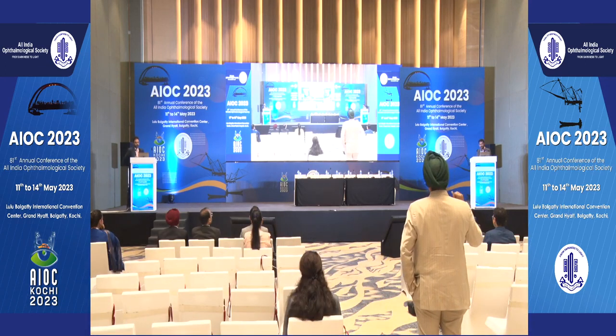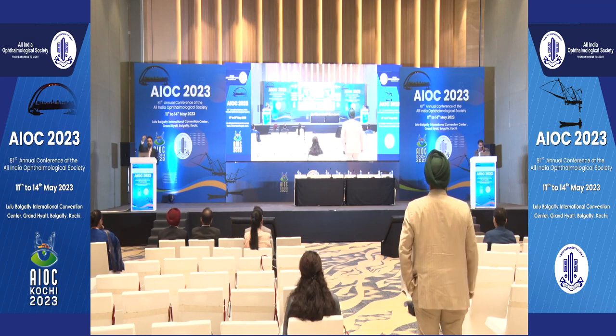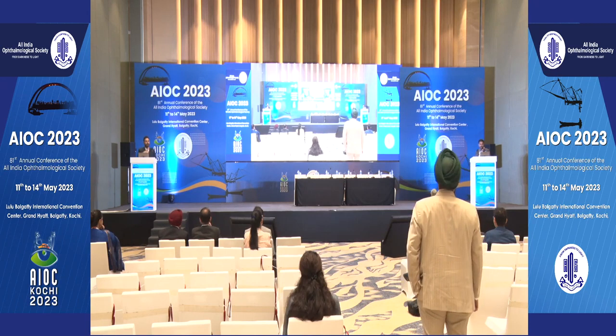Basaf, if you were to take something home from this, do you think the location from the fovea would be a factor in choosing when you want to do it and not? Because this was relatively, I think, within 500 microns from the foveal center where you chose to laser. Simple thing: if you divide the disc into 3 parts, upper one third, middle one third, lower one third, the fovea is in the lower one third. It's common sense we have to avoid that area.